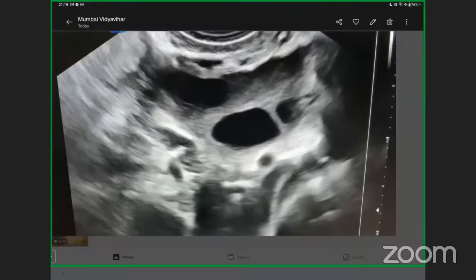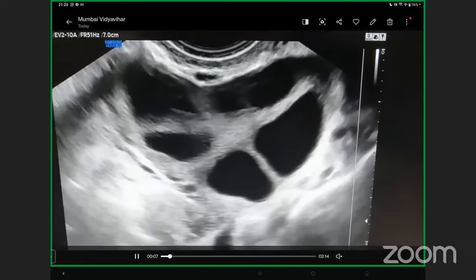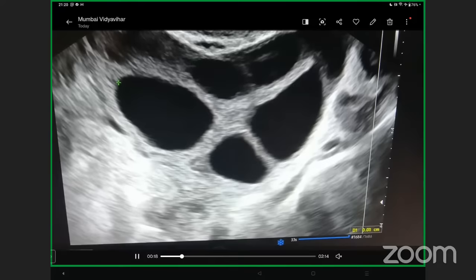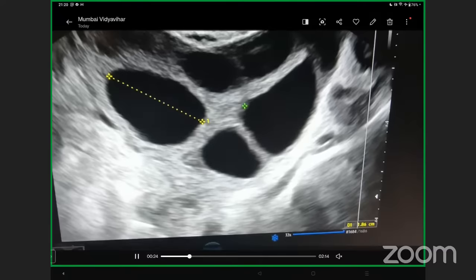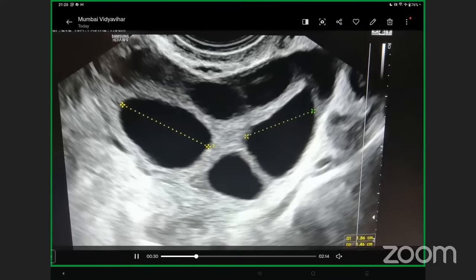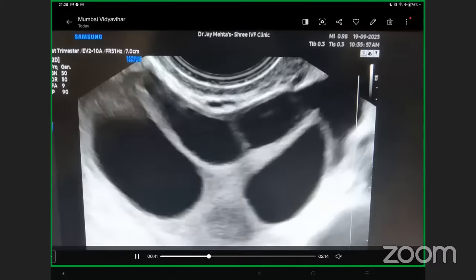This is the live video of the pre-ovulatory follicle — this is where we want to give trigger. We have already zoomed in through our TVS probe and frozen the image. The largest longitudinal perpendicular diameter is 18.6 mm — very good. The second follicle should also be approximately 18 mm. You can take measurements from one end to the other end.